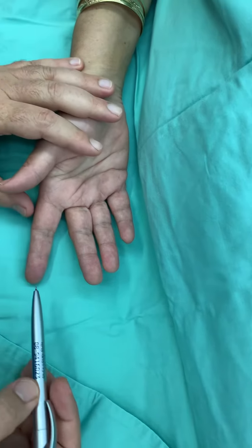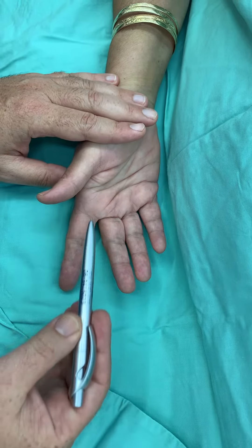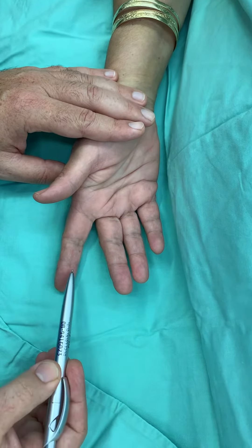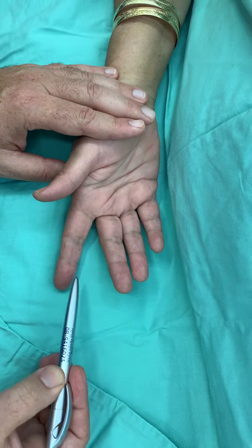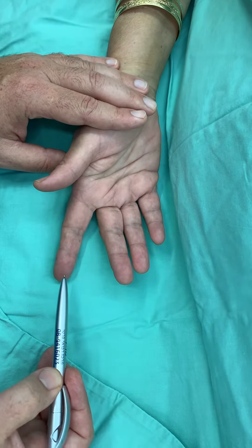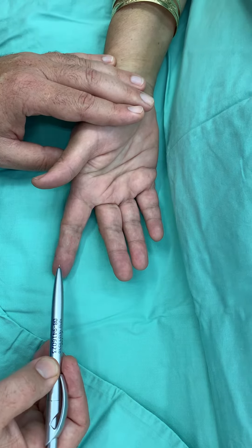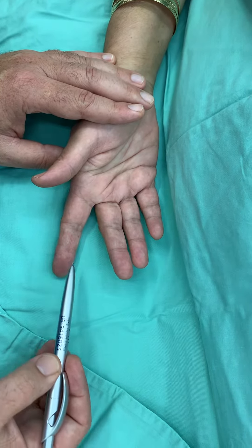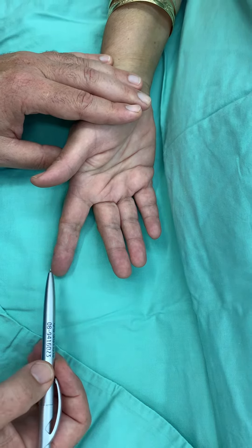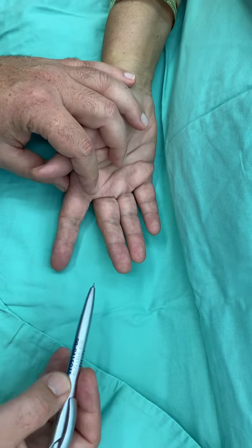This patient has a glomus tumor in her right index finger. It is in the volar area, specifically in the pulp of her right index finger, and hence she has pain. We will now be using the blunt tip glomus tumor mapping method in order to identify the exact area where we expect the glomus tumor to be, and this will be done prior to performing the injection.